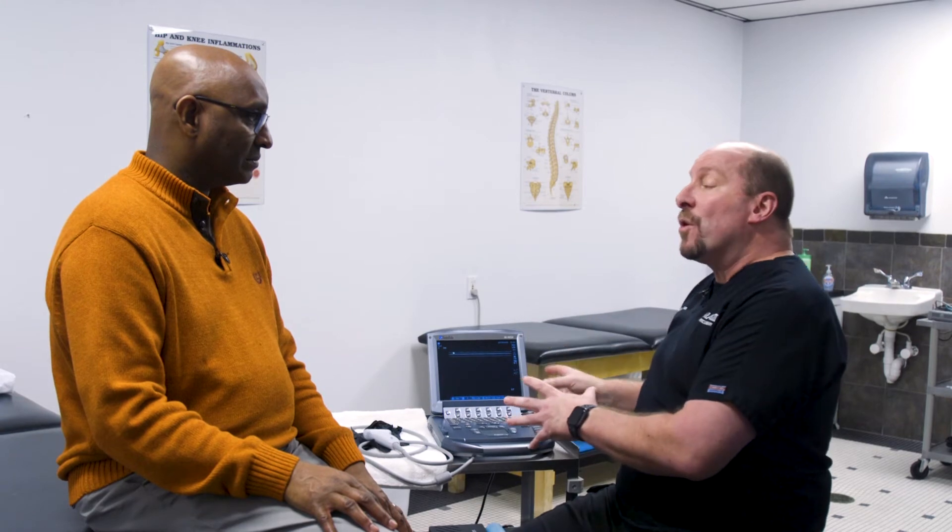Sometimes an MRI might not be able to see a shoulder rotator cuff tear. This will actually show where it is, how big it is, and even show if it is acute — meaning it's recent — or if it is a chronic tear.